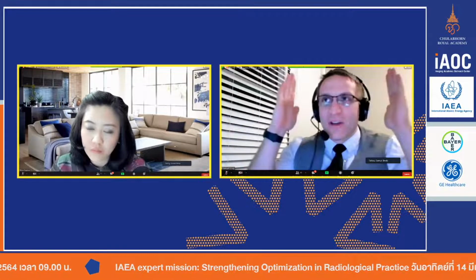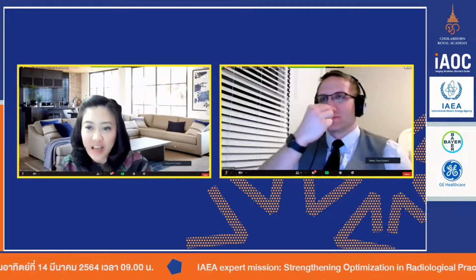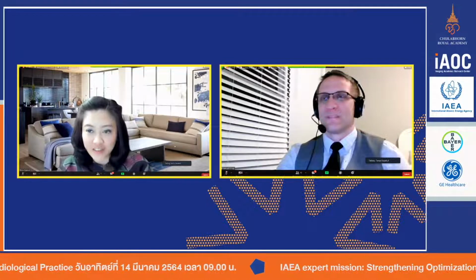If there's air right here versus here, no dose effect, but the image quality will be poor or poorer. So let's put on a different scenario. Let's say the doctors order just a CT thoracic spine, and afterward they ask, do you have any chest images that we can look at along with the thoracic spine? Which means, can we go back to the scanner and ask technologists to change the display field of view and mark it up so we can see the lung findings or chest findings?